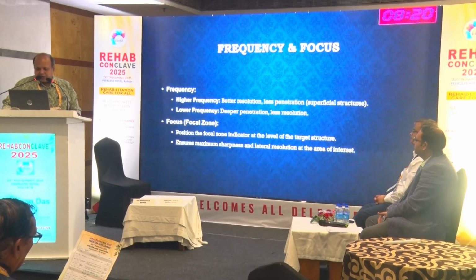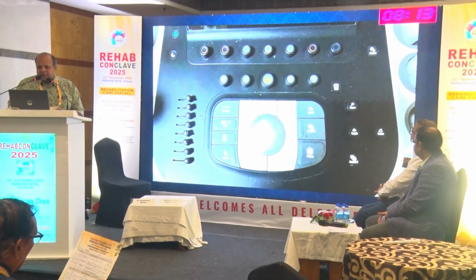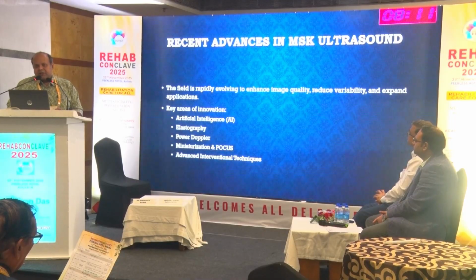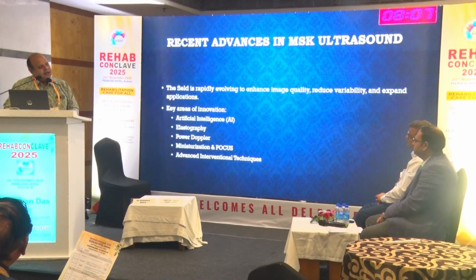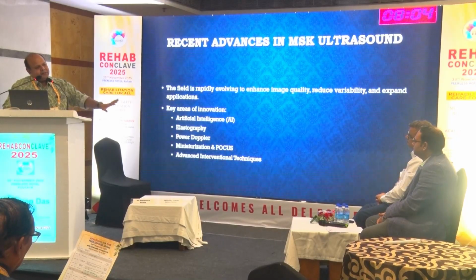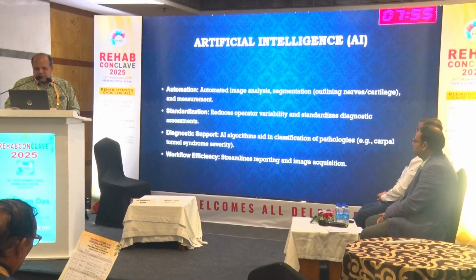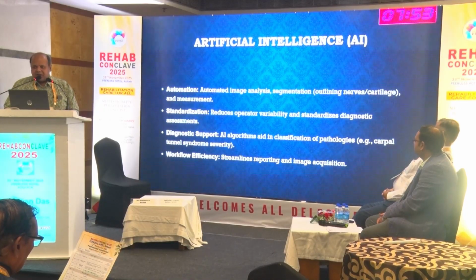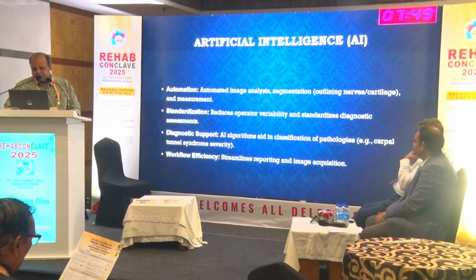Again, I go back to the ultrasound module. There is something called a button, eye scan. You do not do manual modulation of your digital camera; you put it in auto mode. You press that eye scan, and it will almost optimize your images. You may like it, you may not like it. Then also you can modulate it according to your need. So this comes with the artificial intelligence. It reduces the operator variability.